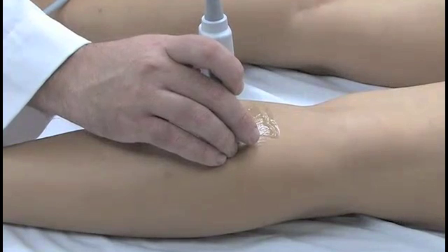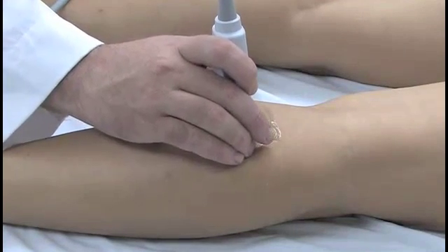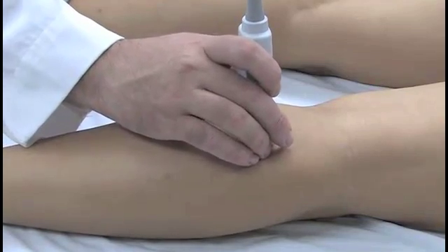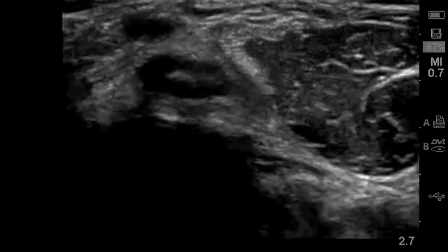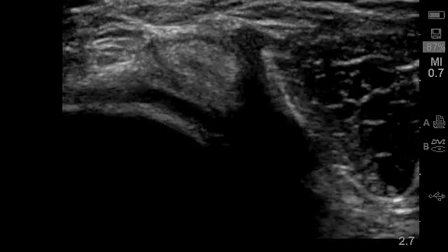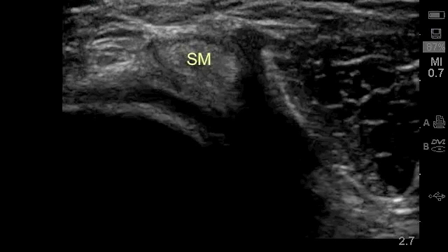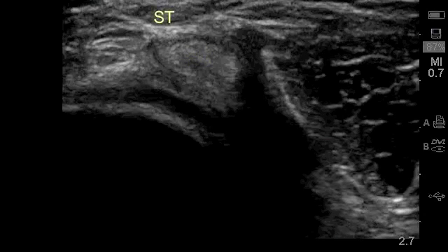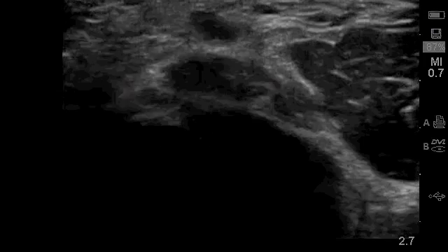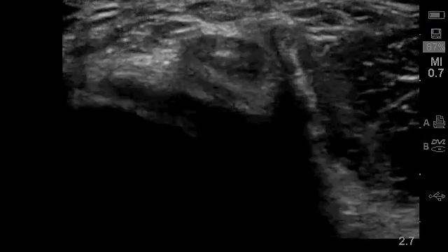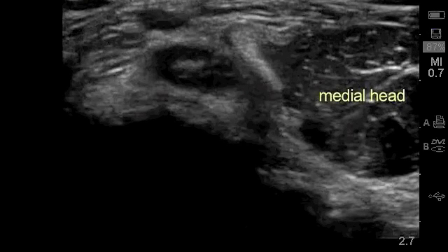Maintaining a transverse orientation, slide the probe cephalad along the medial aspect of the medial head of the gastrocnemius muscle. As the popliteal fossa is approached, the hyperechoic semimembranosis tendon can be identified as a round structure medial to the medial head of the gastrocnemius. Just superficial to the semimembranosis tendon is the semitendinosus tendon, which is about half the size. Lateral to these structures is the medial head of the gastrocnemius, with its tendon somewhat comma-shaped at the medial margin of the muscle belly.